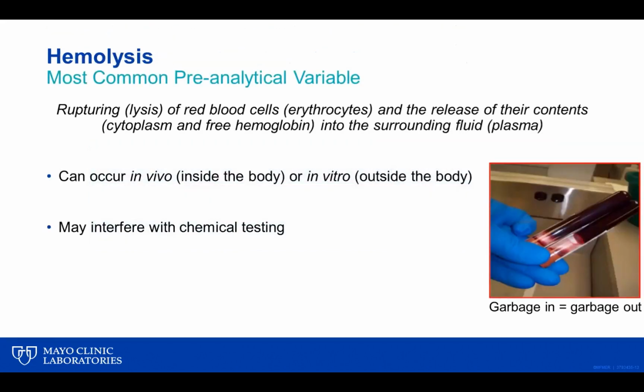So as I mentioned, hemolysis accounts for the greatest number of specimen recollections, and not only among the ED practice, but really the rest of the inpatient hospital practice as well. And I would say it's pretty safe to say that hemolysis is the most common pre-analytical variable encountered at most, if not all hospitals, likely including your own. And so what exactly is hemolysis? This is defined as the rupturing or lysis of red blood cells and the release of their contents, usually the cytoplasm and free hemoglobin, into the surrounding fluid, which in this case is plasma.